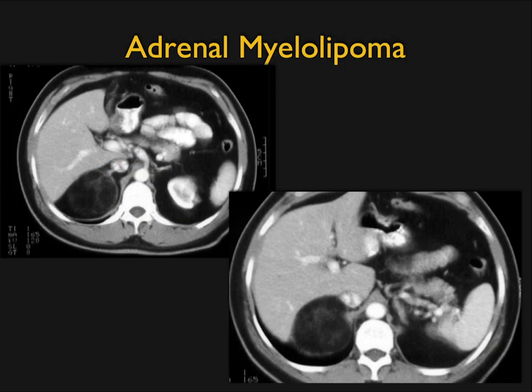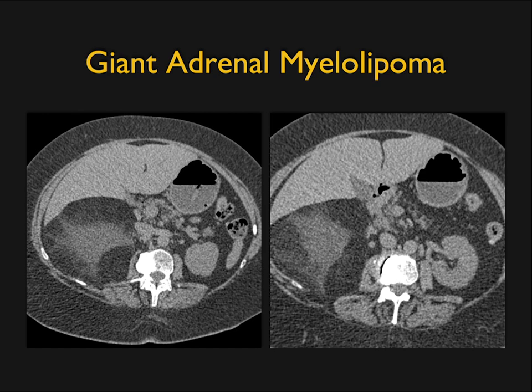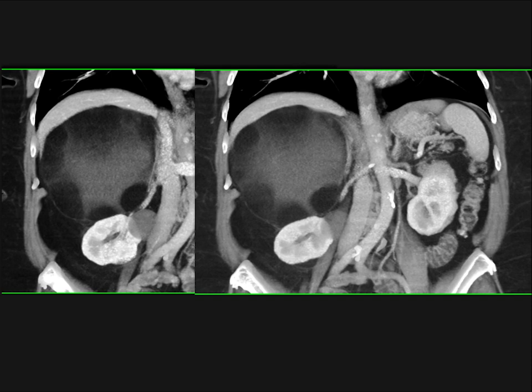Under adrenal incidentalomas: when something is all fat, it's a myelolipoma — leave it alone. Over 5 cm they can bleed, so we resect. Sometimes the amount of fat is minuscule, but the combination of fat density and calcification still indicates myelolipoma. Sometimes they're very large, with high density indicating previous bleeding. Some say resect anything above 5 cm, others say above 8 cm — symptomatic patients are resected quickly. You don't want a case of substantial hemorrhage where the patient can exsanguinate.